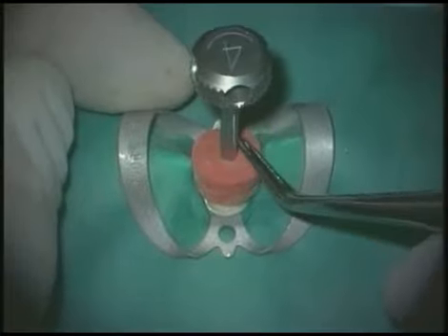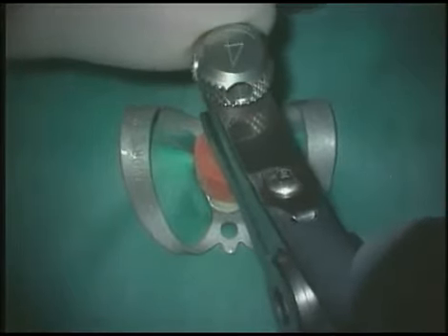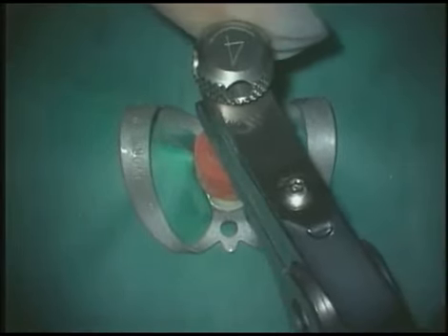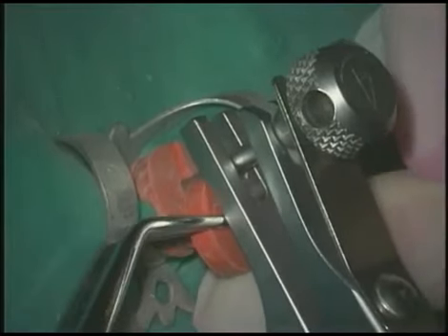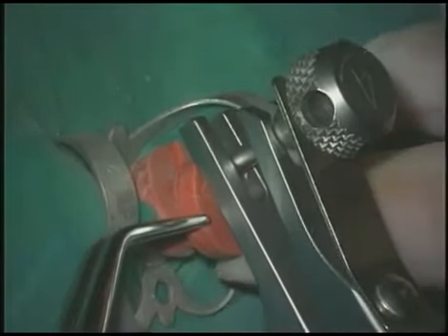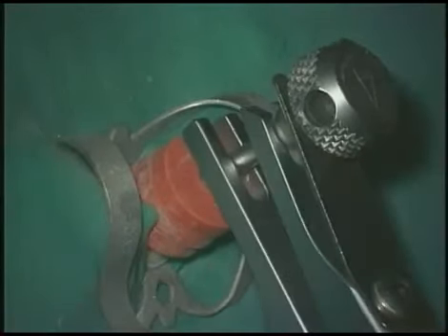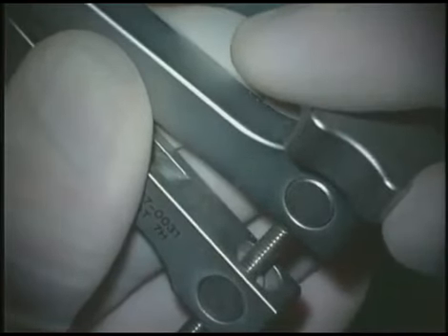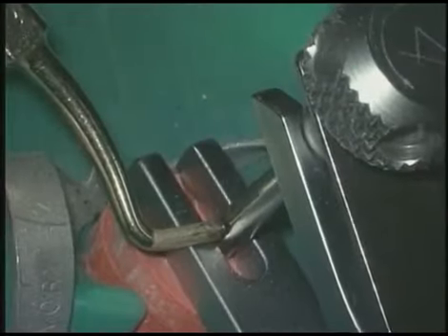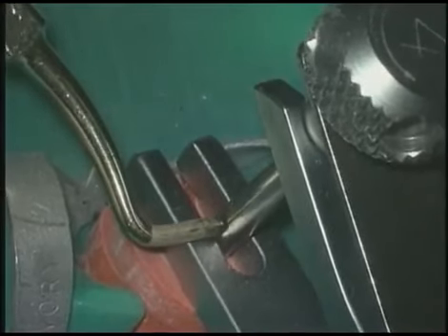Notice with the proximity of the adjacent teeth and their incisal edges, we're using a second, and sometimes we'll find out as we begin to insert the extracting plier that we might even need to place a third one. This will kick the lower jaw further away from the adjacent teeth so that we can introduce the extracting pliers safely. Slowly and progressively turn the screw knob. If the handle ceases to turn easily, then we employ ultrasonics, as has been previously described.